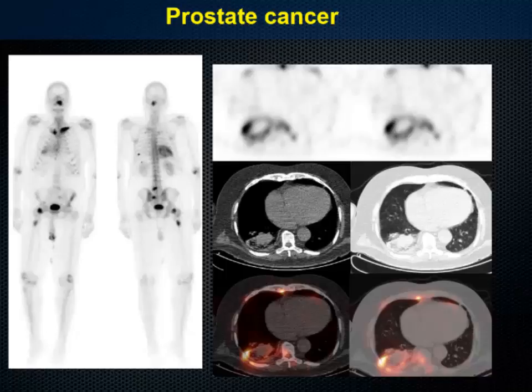But again, my first thought was, as soon as I saw, I thought it's the liver. That's what it looks like, because there are a lot of papers which have come out that there will be uptake in the liver, but also in the lung. But often we see that in malignant pleural effusion where there is a diffuse uptake, but solitary uptakes vary from patient to patient. In this case, it could be a lung primary, or the patient may have a dual pathology going on. So SPECT CT also brings in questions and dilemmas, so that it adds to a definitive management strategy later on.